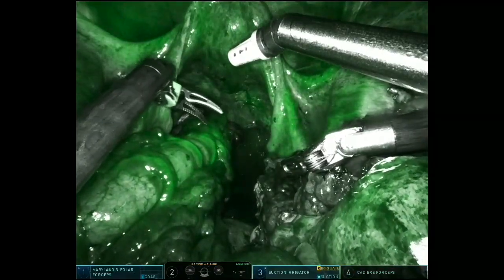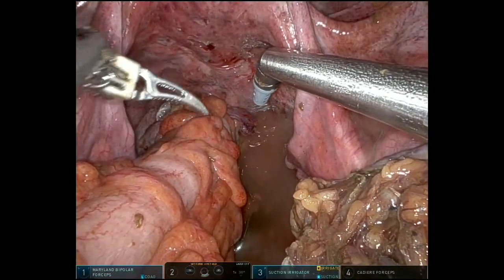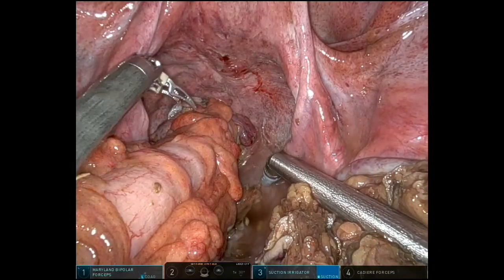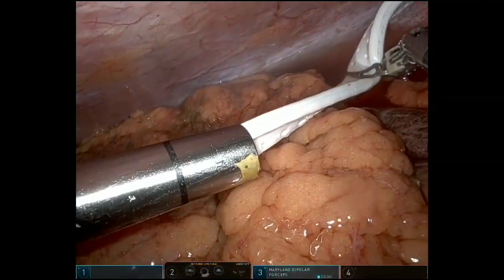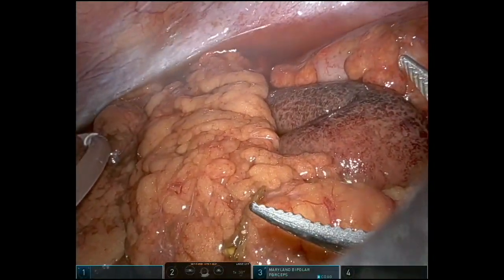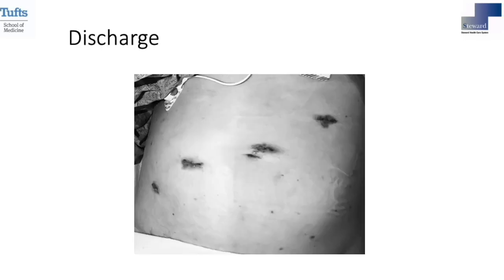Here we used the ICG again, followed by introducing 10 French JP drains. Operative time was just above two hours on the console, and blood loss was minimal. This is the photo prior to discharge within two weeks from the hospital, showing the patient in her recovery.